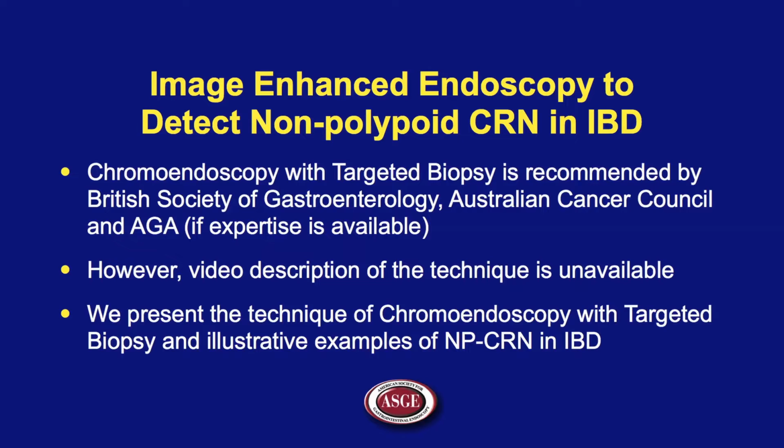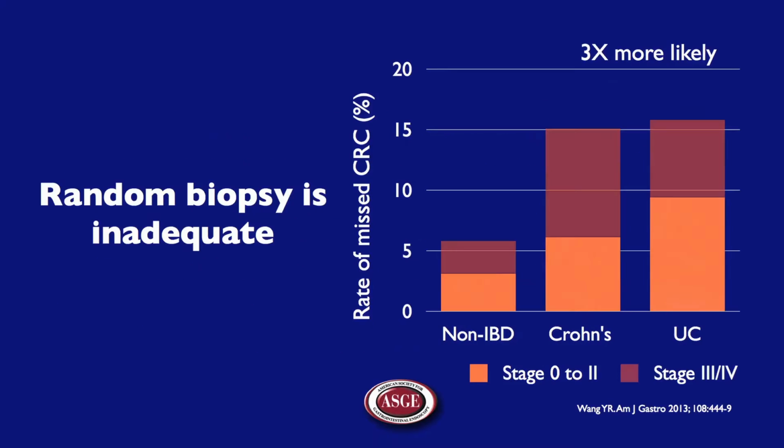However, learning the method can be challenging as video descriptions are rare. Here, we will describe the technique and several illustrative examples. Studies suggest that the current standard of random biopsies to detect dysplasia in IBD patients is inadequate.